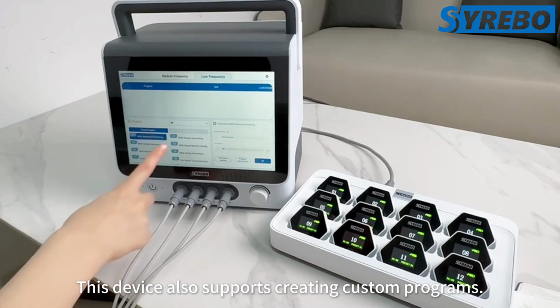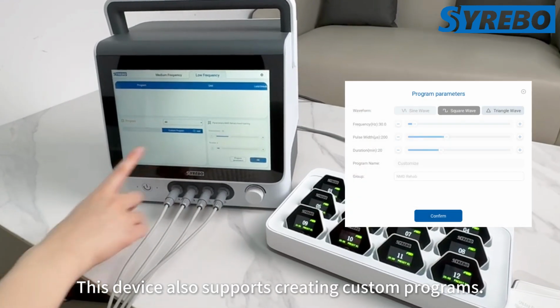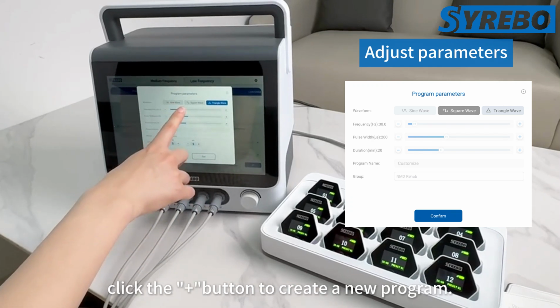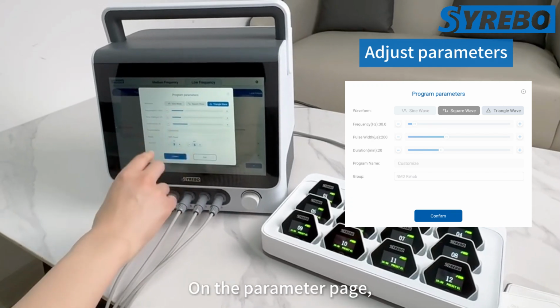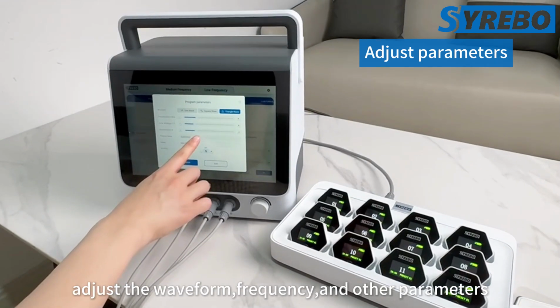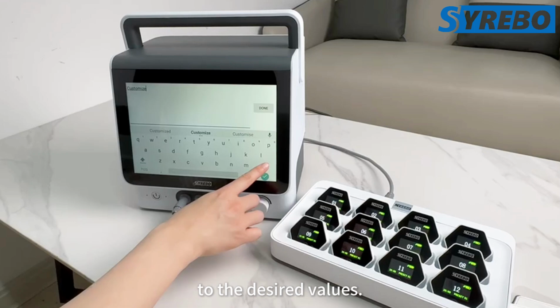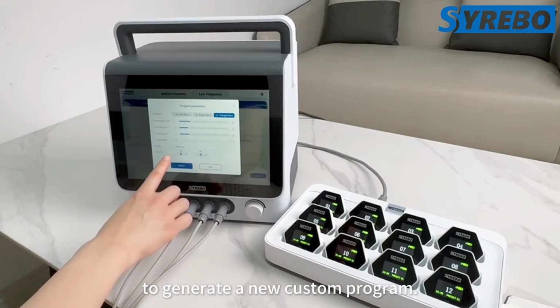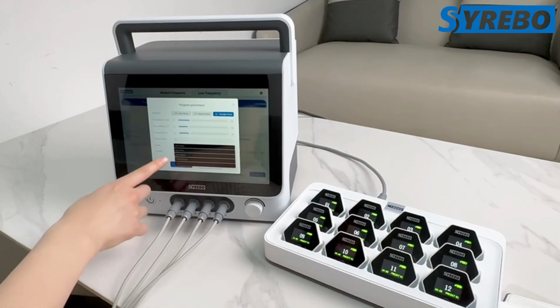This device also supports creating custom programs. In the custom program interface, click the plus button to create a new program. On the parameters page, adjust the waveform, frequency, and other parameters to the desired values. After naming the program, click the confirm button to generate a new custom program.